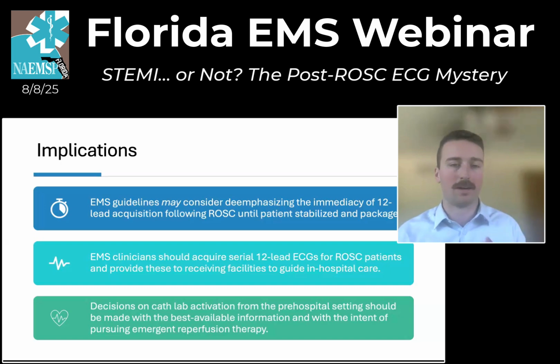But even aside from that, there is definitely a lot of value in getting serial 12 lead EKGs. It should really be encouraged to crews that we should be getting more frequent 12 lead snapshots throughout transport and packaging to really provide a better picture of what is going on with our electrophysiology, with potentially our myocardial ischemia during the course of our care following resuscitations. And this can thereby really help to guide in-hospital care as well. Emergency clinicians, interventionalists can then sort of see how things are progressing during a patient's post-resuscitation care.